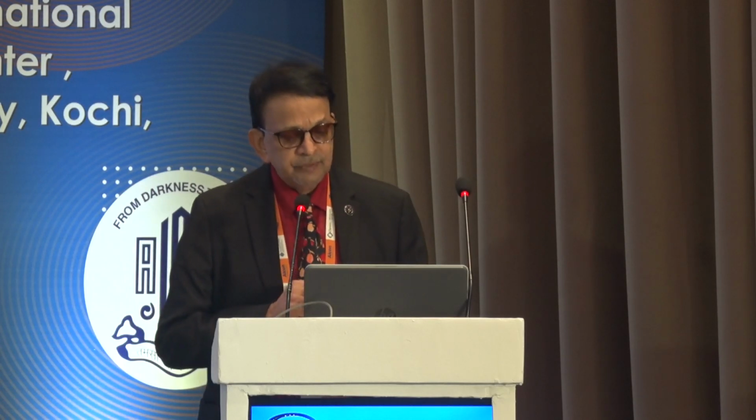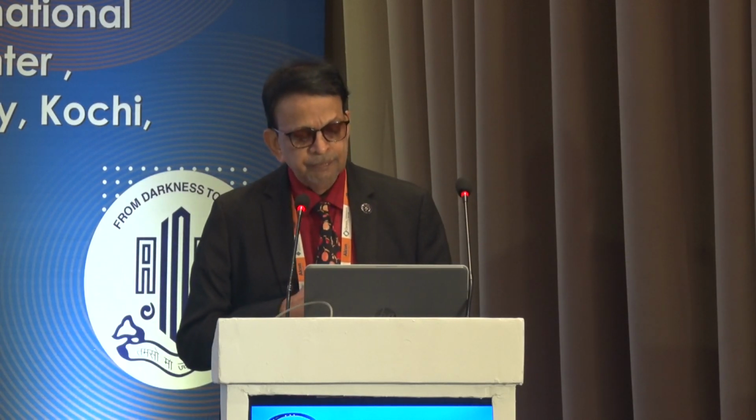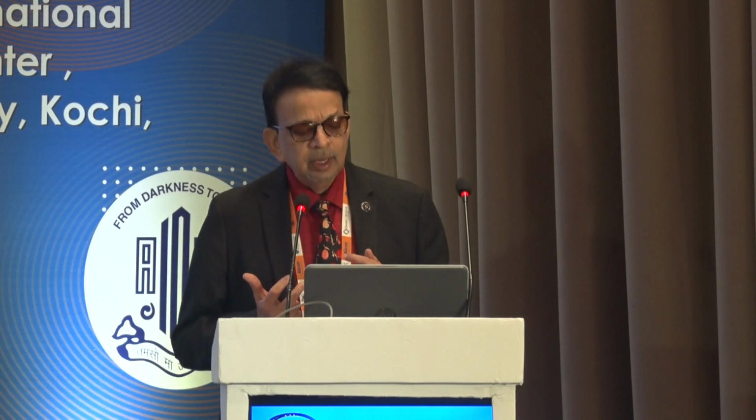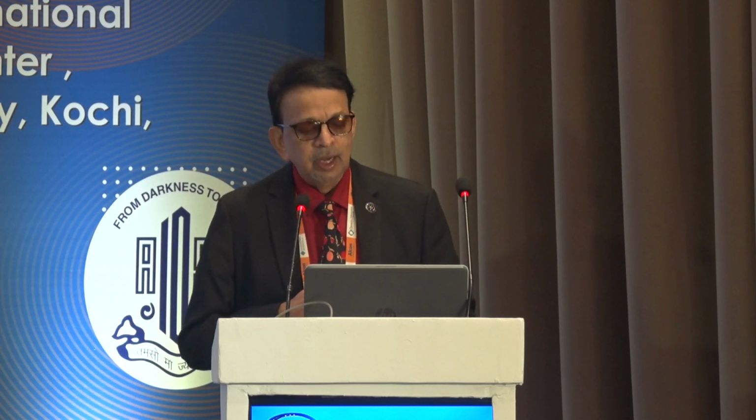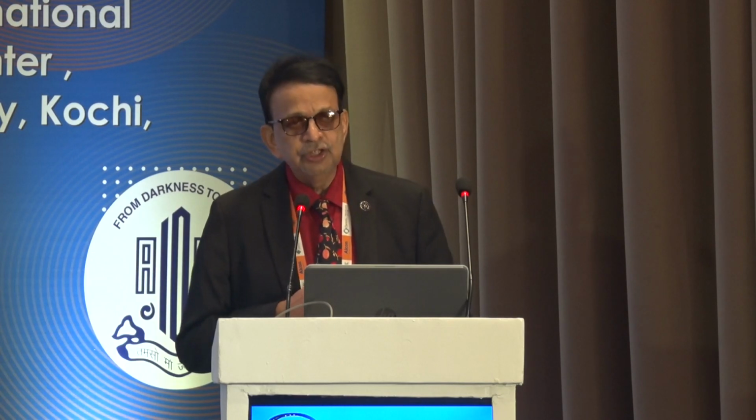Just to show you one similar case, a brown black cataract, you can see here. The rhexis is already done. The pre-chop is already done. I just need to go in, and you can see here I'm chopping that. You can see very clearly that the gas bubbles are coming from behind. It shows that the chop has gone all the way into the posterior nuclear plate. I just have to bury the phaco using very minimal phaco power. Apart from that, the chopping is becoming very, very easy, because I already chopped and the rhexis is also beautifully done, and it makes life very easy. Once I separate the nucleus into smaller pieces, then the rest of the phacoemulsification is like child's play for you.